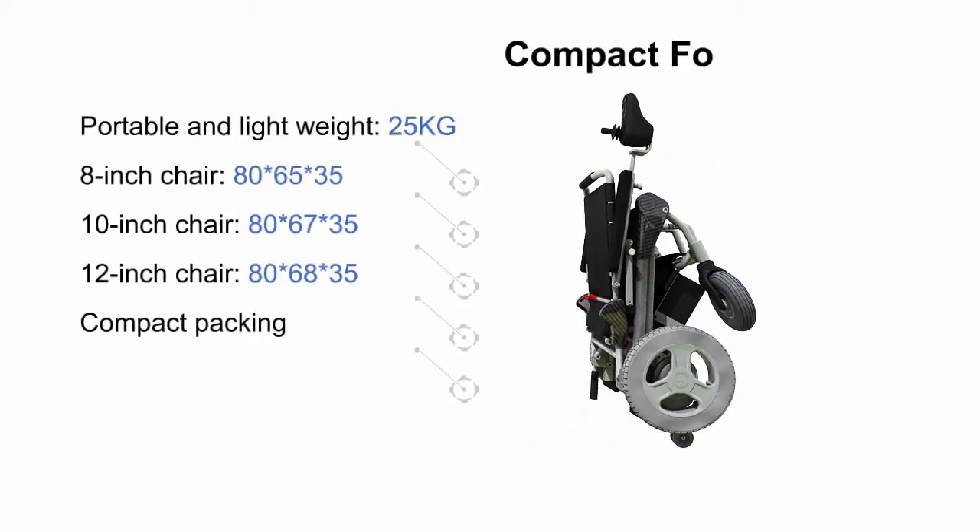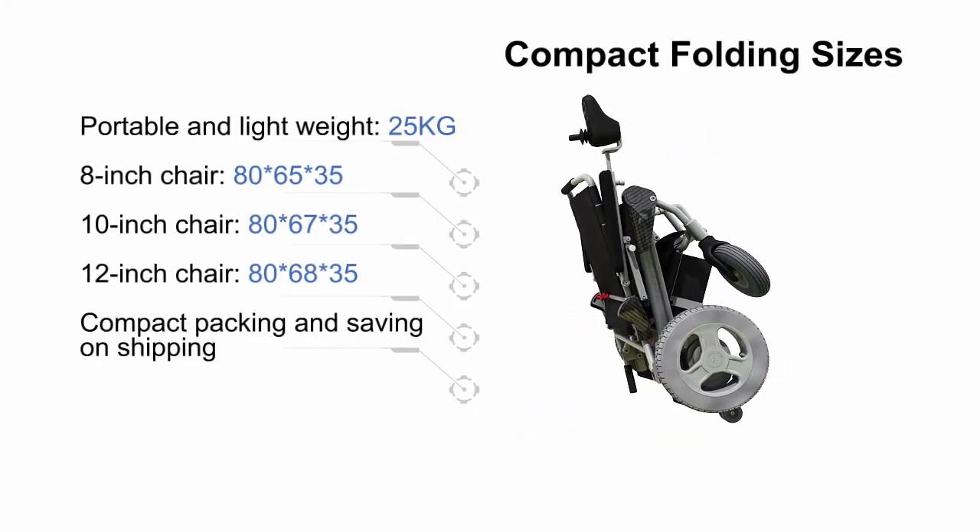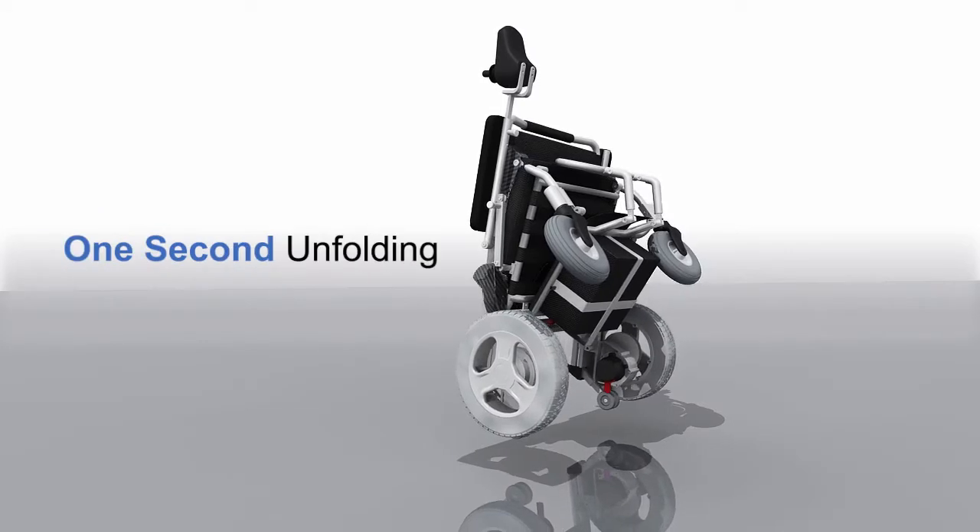Compact folding sizes. 1-second unfolding.